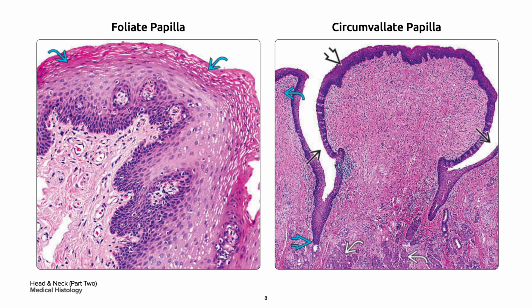On your left is the foliate papilla that can have rare taste buds and are lined by a thin stratified squamous epithelium with minimal parakeratinization in curved blue arrow. The connective tissue stroma, which contains many small blood vessels and nerves, is shown on your left.